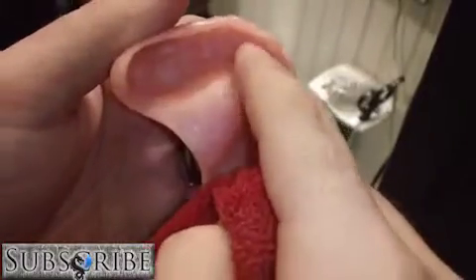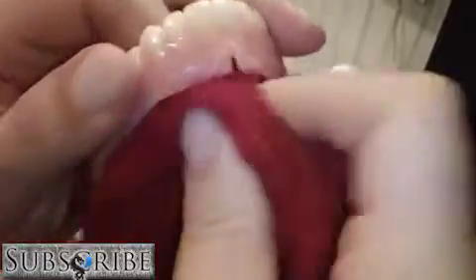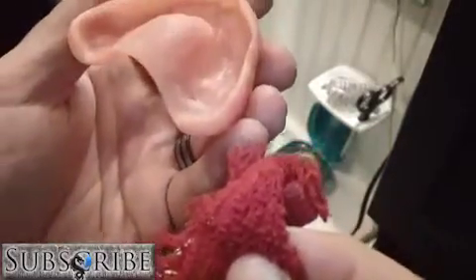Go like that, go like this. Just pay attention, you can see. Usually you end up having a little bit of water right here, or in the back corners, depending on the contour of your mouth and the contour of the dentures. So you can bunch it up like that. Go like this. And if all else fails, you can take the corner that has a lot of strings, if you have one like that, and just get it on there. These don't have to be nice. You just got to be functional. So anyways, that's pretty dry.